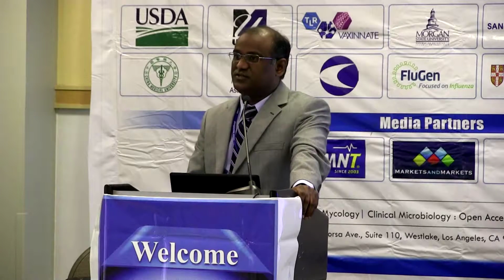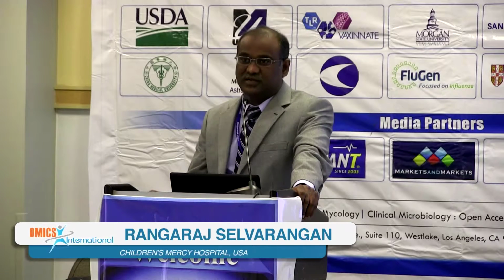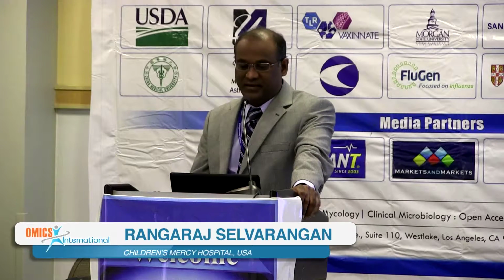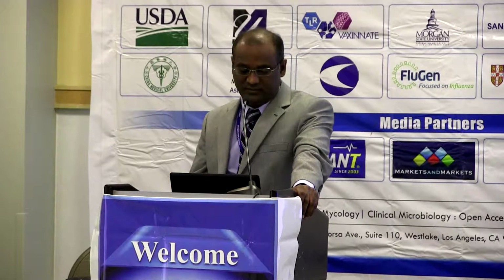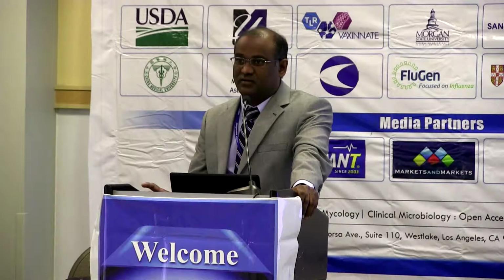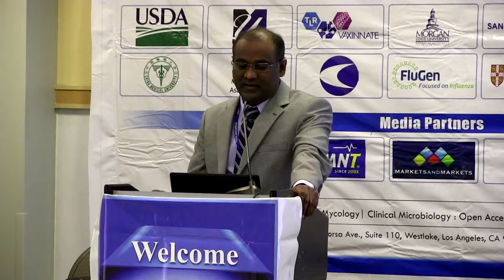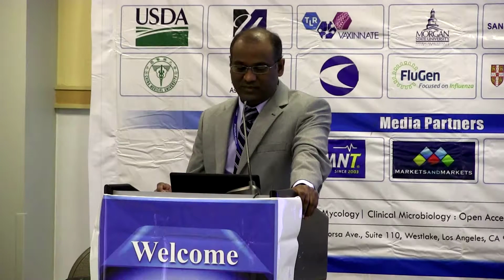So looking at some of the traditional methods that were available, influenza culture. The tube cultures, primary monkey kidney or MDCK, which are good cell lines, or the mink lung cells, are also pretty good for culturing the influenza virus. Now, these tube cultures take a long time to grow these viruses, up to a week or more. And so as rapid diagnosis, they do not fit well with the current needs of the clinician who faces the patient in an outpatient setting.